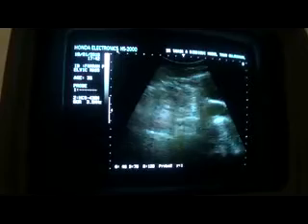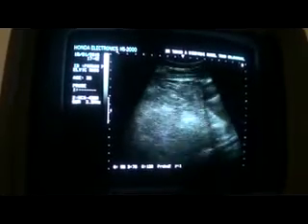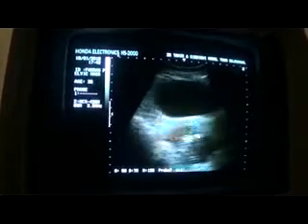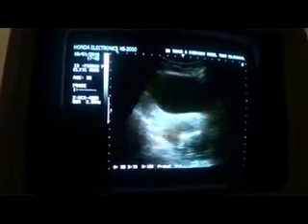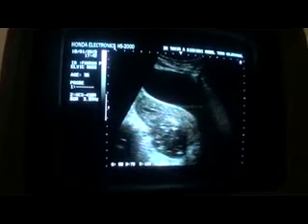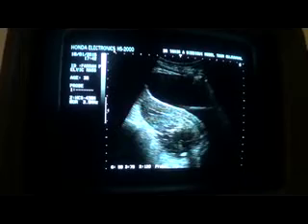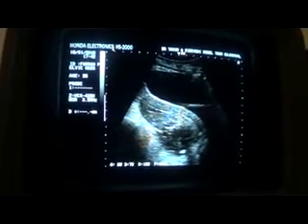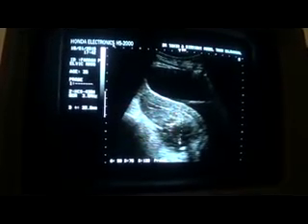Is there any other finding relating to this? I cannot reach the vagina clearly by transabdominal approach because of the pressure from this collection on the uterus.